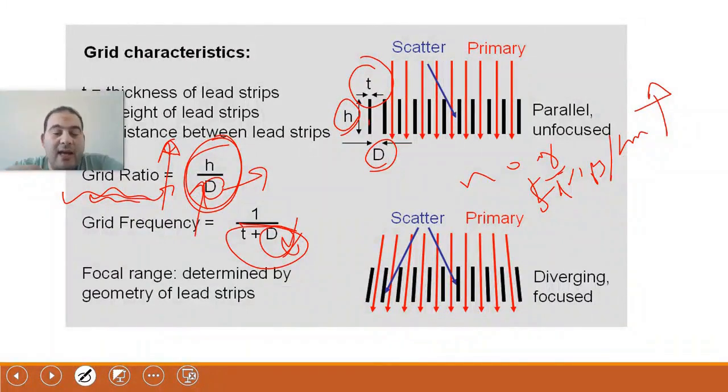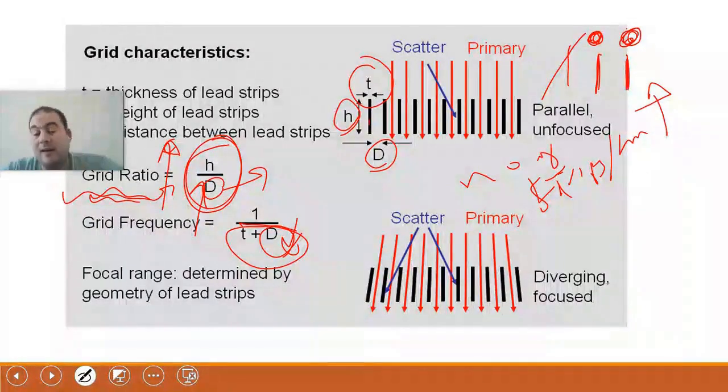Well, right now, okay. If I have here a strip and there is a strip, for example, if there are many strips, what will happen? The number of strips will increase the chance of photons falling on the strips themselves, right?